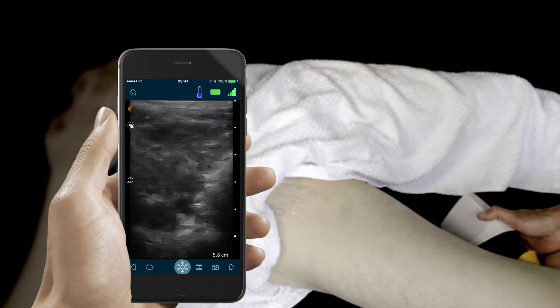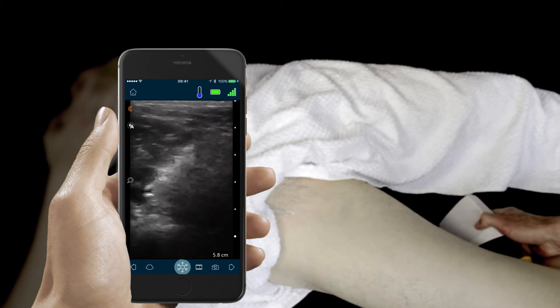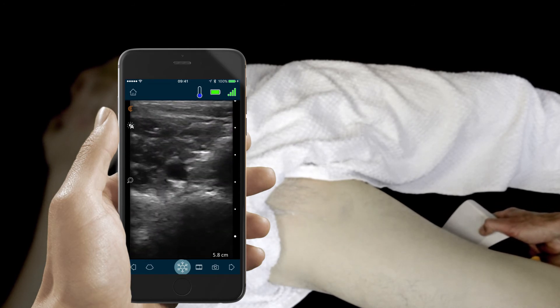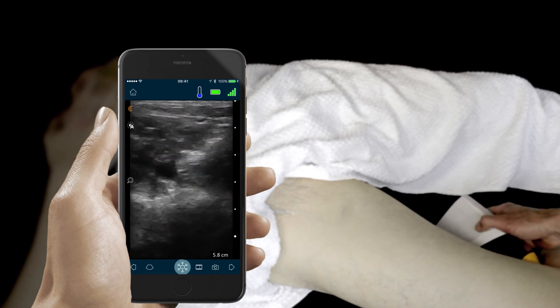Next we'll move to the popliteal fossa where we'll visualize the popliteal vein, which usually is just superficial to the popliteal artery, and again compress the popliteal vein completely to demonstrate no sign of clot inside the vessel.